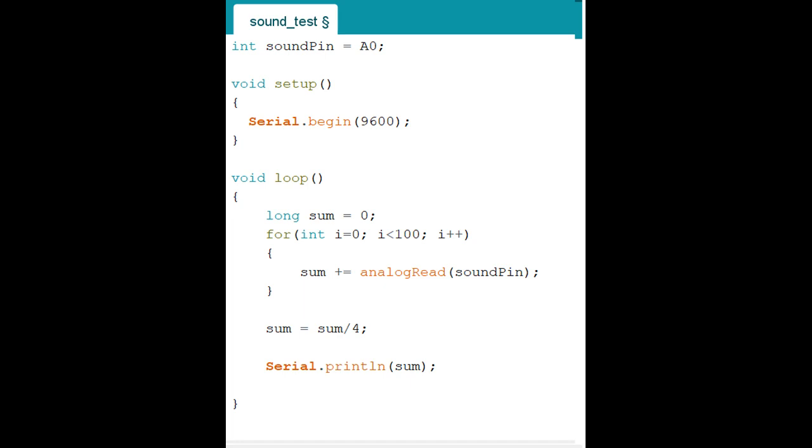So basically, sum is A0, right? But we have to let it know you have to read, and you have to convert it to a number, and you have to let it know that it's a sum. I hope everything is good. Okay, so everything is assigned. You put a semicolon and enter, and then you close the brace. And now I'm going to call sum equals the sum divided by 4 and semicolon.